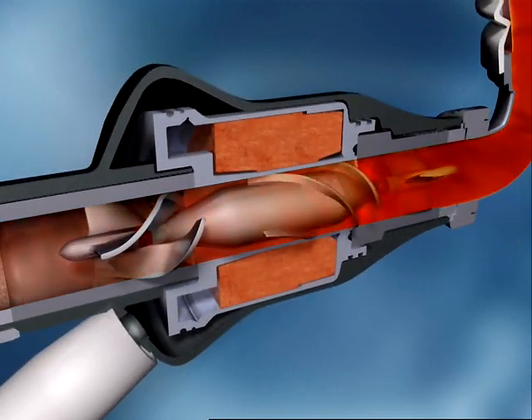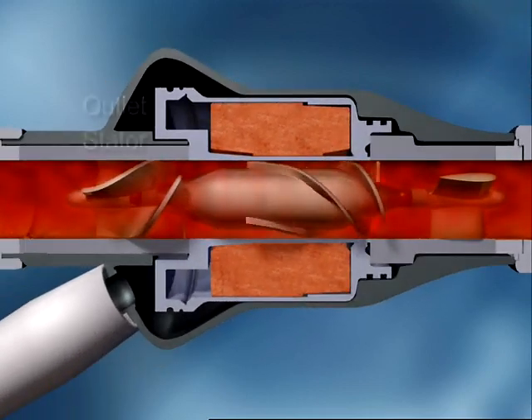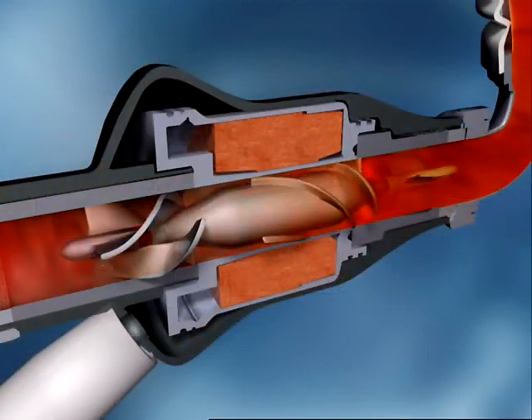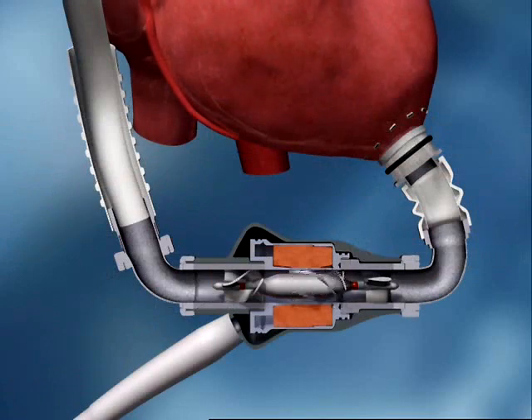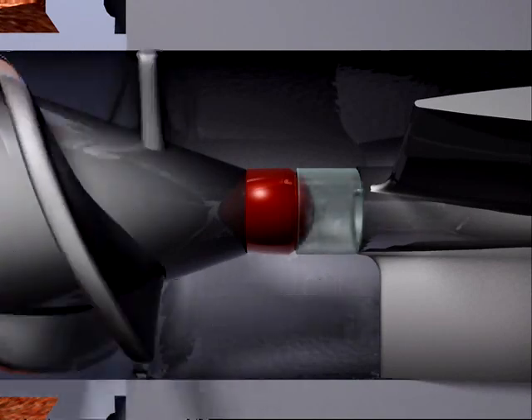The rotor then spins the blood radially and propels it toward the outlet, where blood flow is straightened by the outlet stator vanes. In typical operation, the pump runs from 8 to 10,000 RPM. The HeartMate 2's patented ball and cup bearings are designed for long-term reliability and the minimization of blood damage.